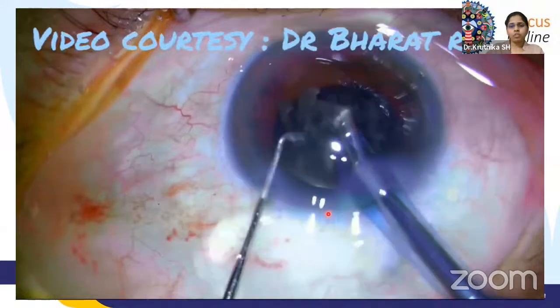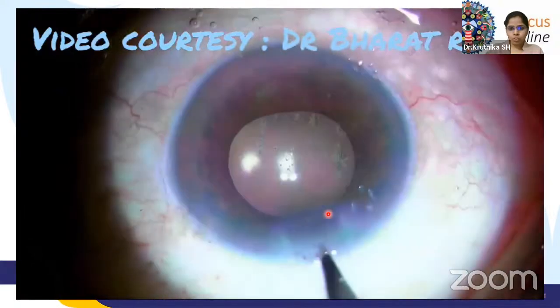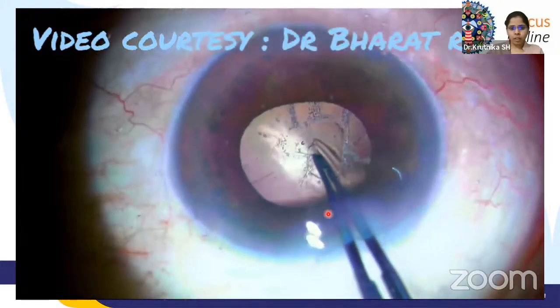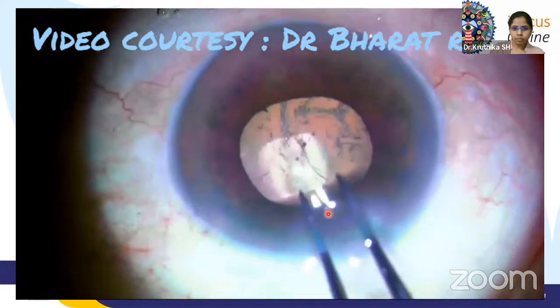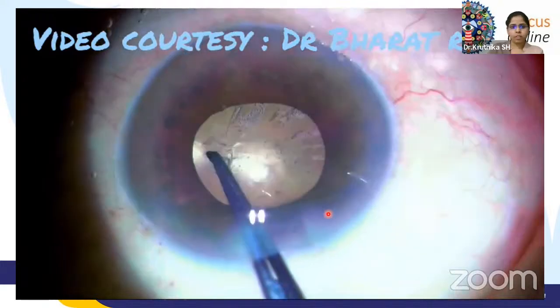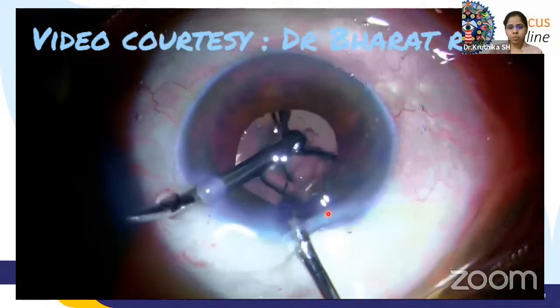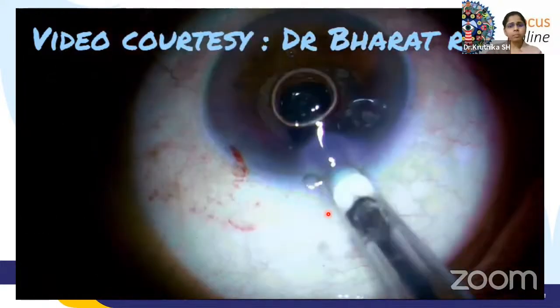After completion of routine phacoemulsification and cortical matter aspiration, the surgeon makes a posterior nick, that is a nick on the posterior capsule, following which posterior capsulotomy is completed by using a forceps. Again here, a gentle tractional force is given circumferentially. Following completion of the posterior capsulorhexis using a forceps, in this case, what the surgeon does is, from the left port, as we can see, he has used an irrigation cannula to remove the silicone oil, and from the main port, sir has used a cannula to depress the scleral lip, because of which all the silicone oil comes out en masse, as we could see, after which the IOL was placed.